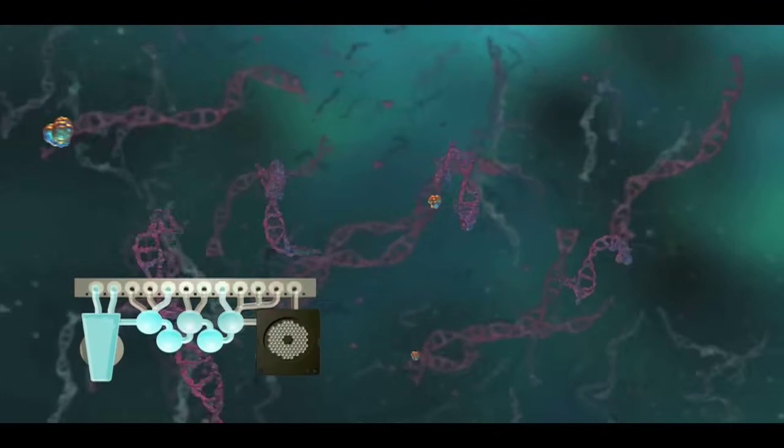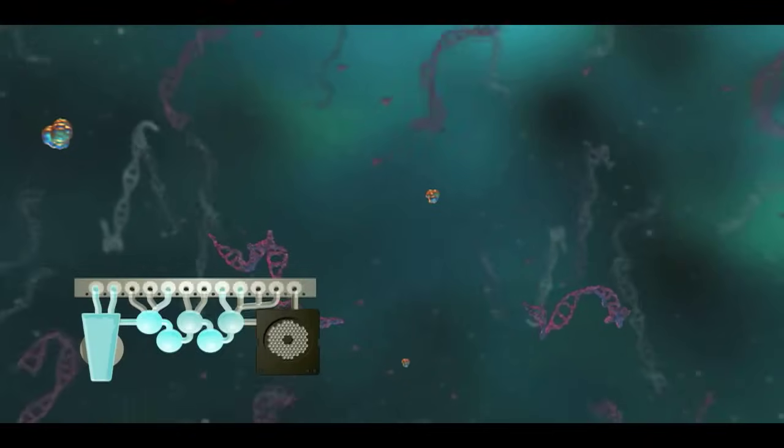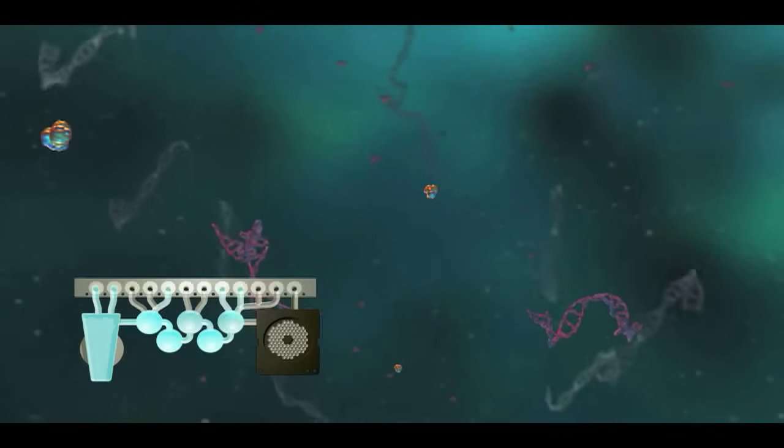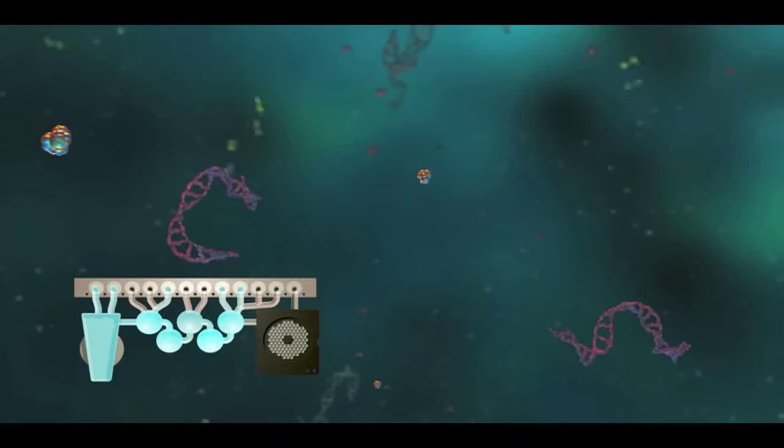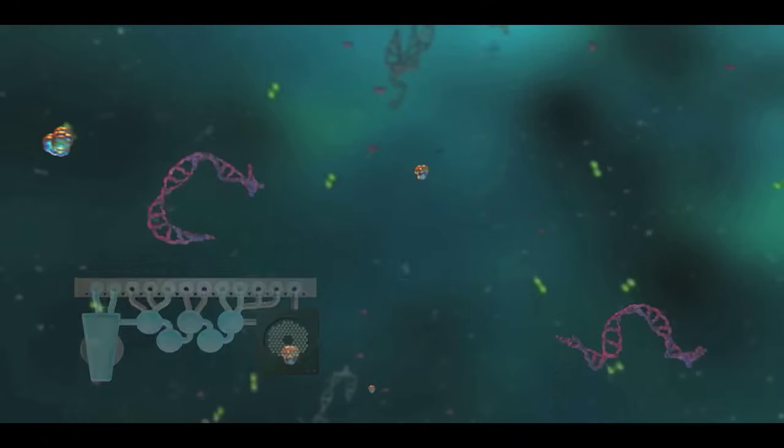The products from the first stage PCR are then diluted to limit any remaining first stage PCR primers. Next, the diluted first stage PCR products are combined with a fresh master mix and then aliquoted to each well in the array.